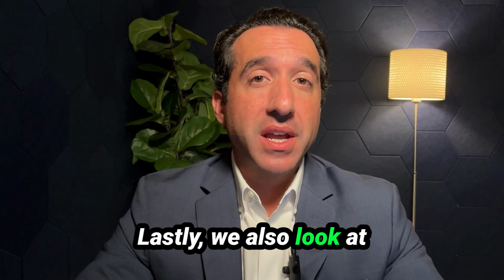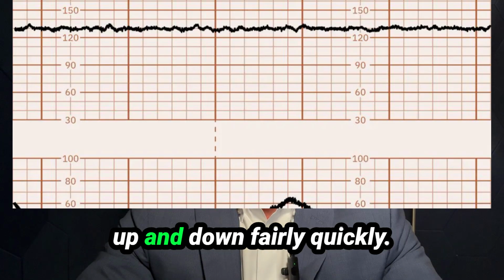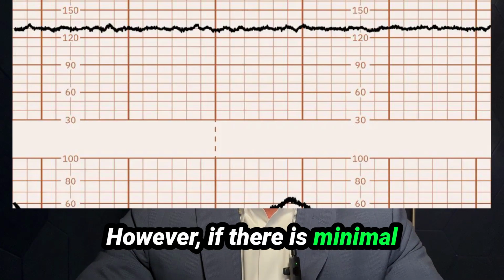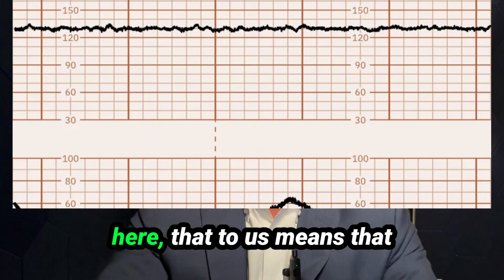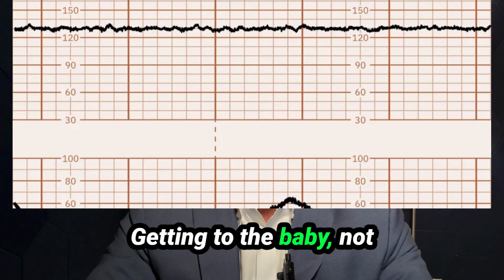Lastly, we also look at the variability of the heart rate. Typical babies' heart rates go up and down fairly quickly. There's a rhythm to them. However, if there is minimal variability, almost like a straight line that you'll see here, that to us means that there's not enough oxygen getting to the baby.